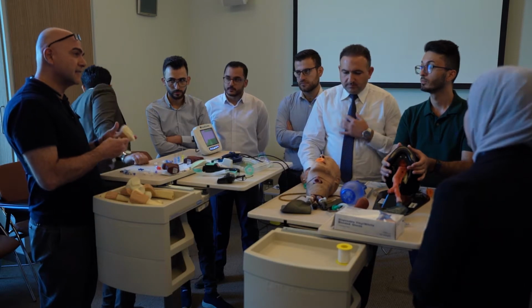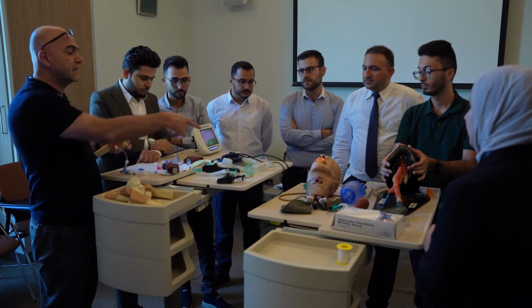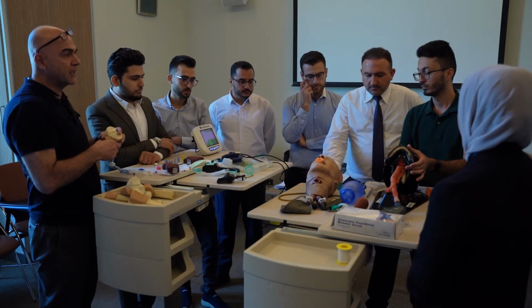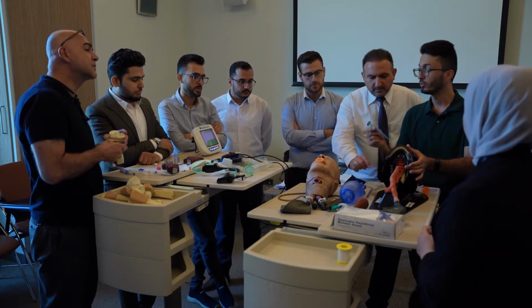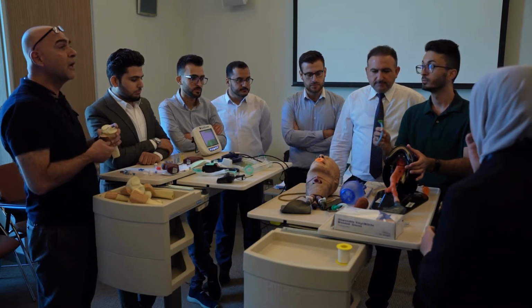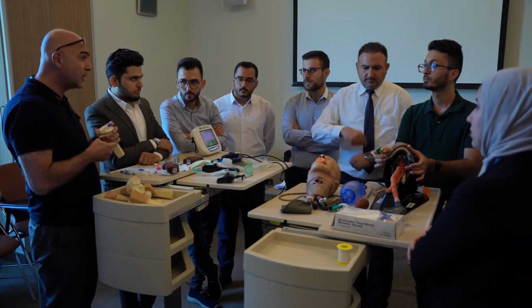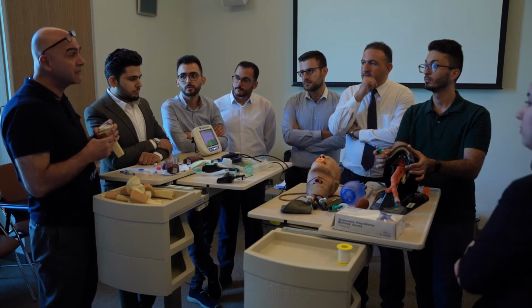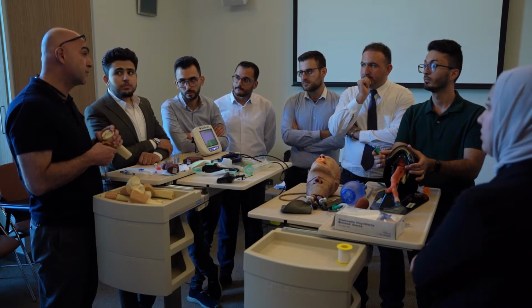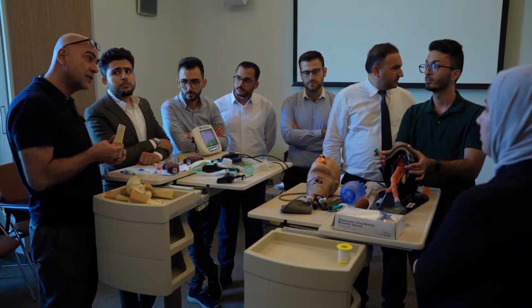There is a device. You have two devices called basic airway adjuncts. One of them is this one, called oropharyngeal airway, and the other one is the tube in front of you, which is called nasopharyngeal airway. Oropharyngeal airway is fit for any patient if there is no gag reflex. When you evacuate the mouth of the patient, if there is a gag reflex, there is no place to put an oropharyngeal airway. If there is no gag reflex, you put the oropharyngeal airway.